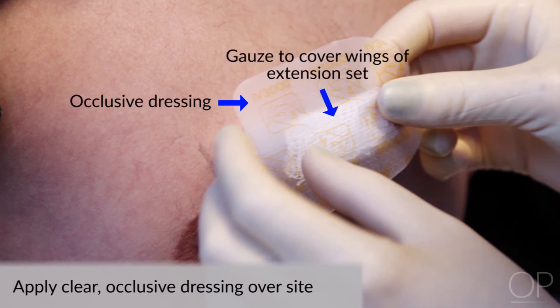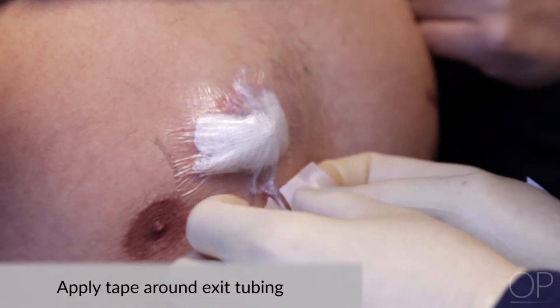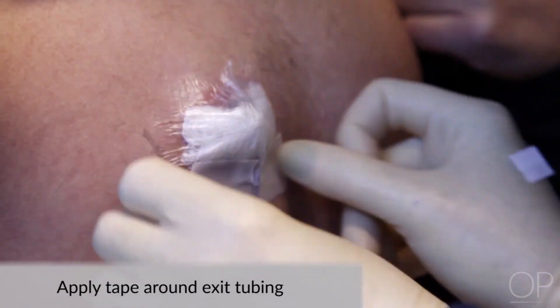If necessary, cover the wings of the extension set with a folded 2x2 gauze to prevent inadvertent removal of the needle when taking off the occlusive dressing. Of note, gauze placement is often used for short-term porticath access to stabilize the needle. If needed in place for a longer period of time for continued needle stabilization, please review your institution's infection control policy regarding how often to change the gauze, as it can be a medium for bacterial growth. Apply tape around the tubing where it exits the dressing to ensure occlusiveness.